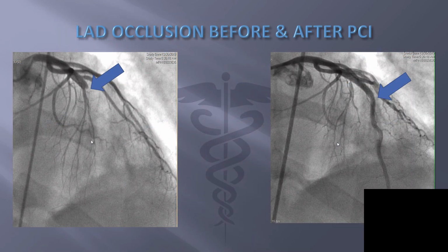This is the angiograph picture of the STEMI. You're going to see 100% occlusion of the LAD, as you can note right there. It's completely stumped off. And then this is the end result after putting the stent in, and it's nice and open there with a lot of reperfusion. And those are the images of before and after the cardiac cath.